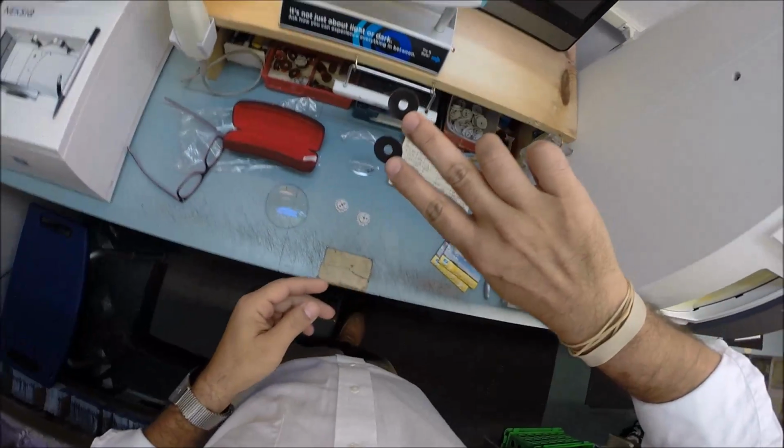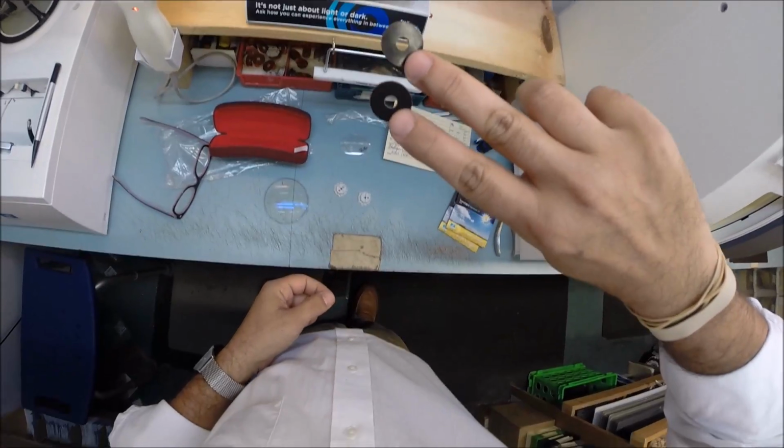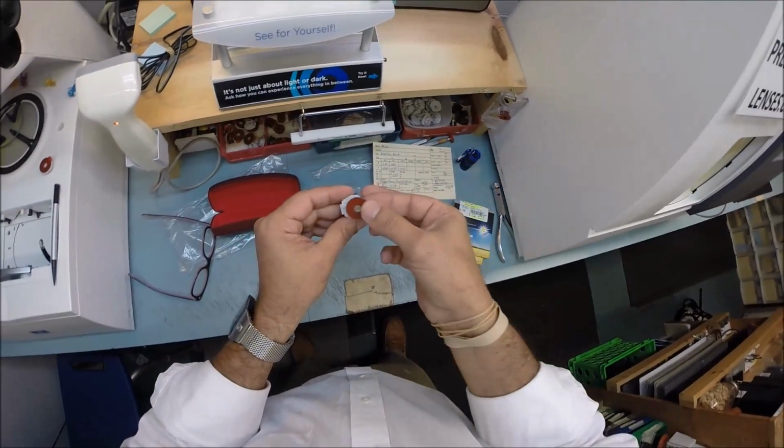So, this is a double-sided adhesive sticker. I'll show you one side, the black side, the sticky side. Let's go ahead and stick that onto the block, or as I like to call him, Jenny from the block.